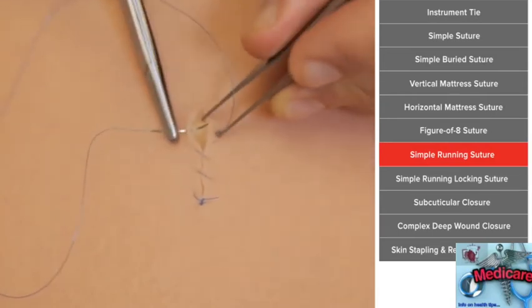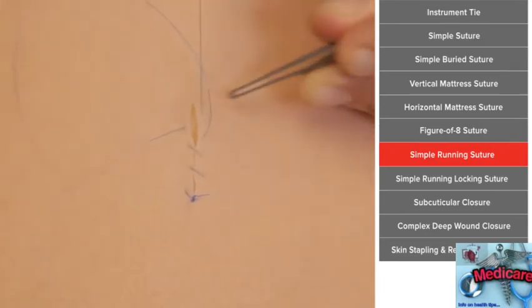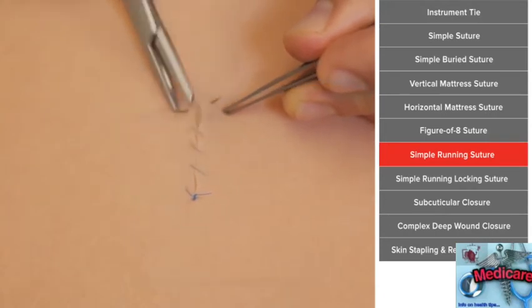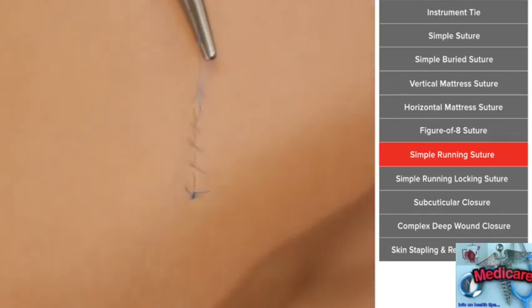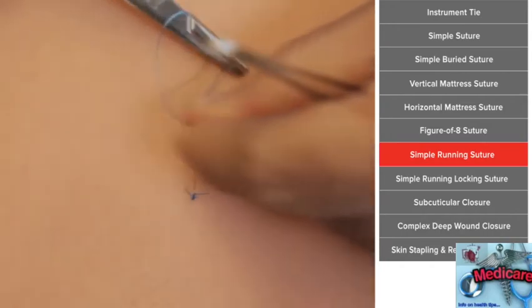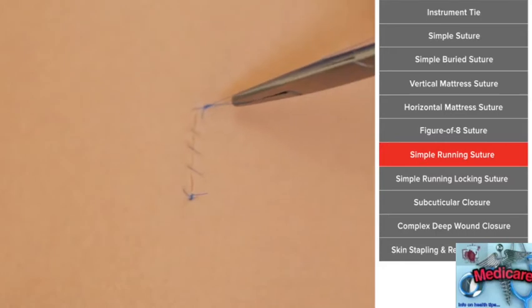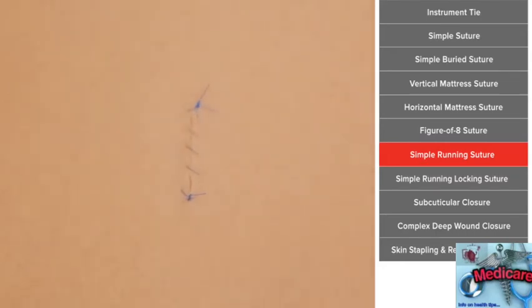Now, because we're going straight across underneath the skin, outside we're going to see a slanted suture, like a baseball. We sometimes call this a baseball stitch. If you want to get really fancy, when you're passing your needle deep to the skin, if you pass it on a diagonal, your stitches will look like they're straight across. So there are different ways to do it, depending on how you want it to look. This is a suture that we use all the time because it's fast and efficient.